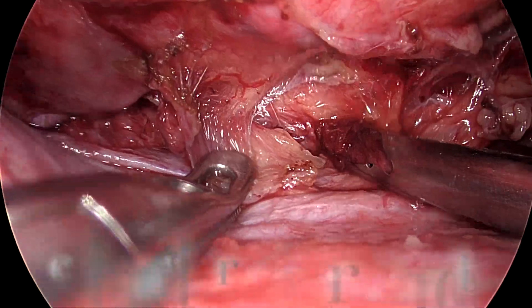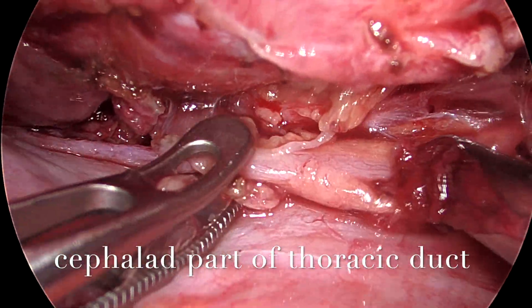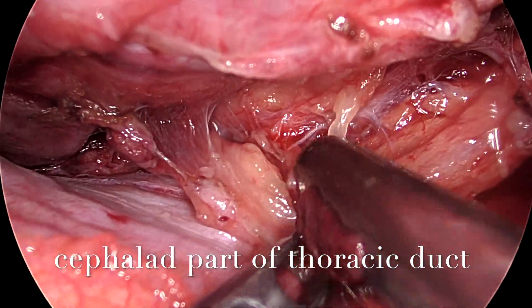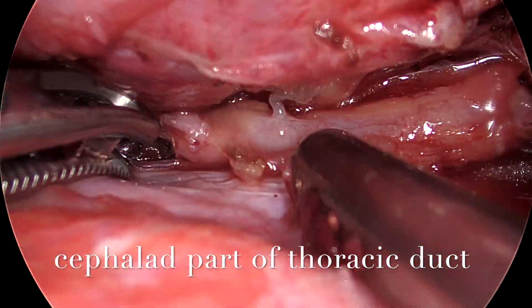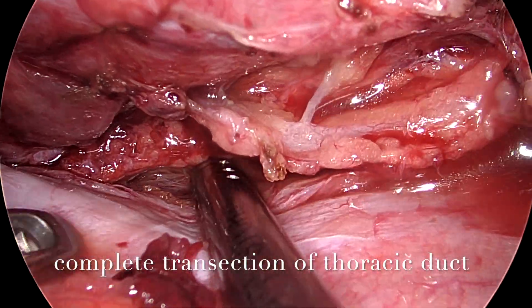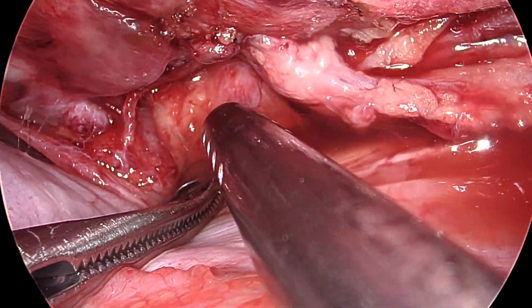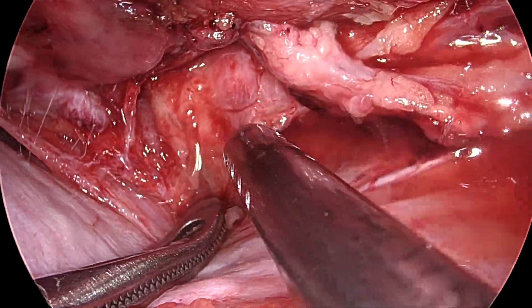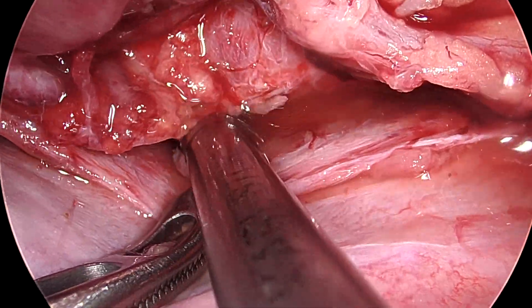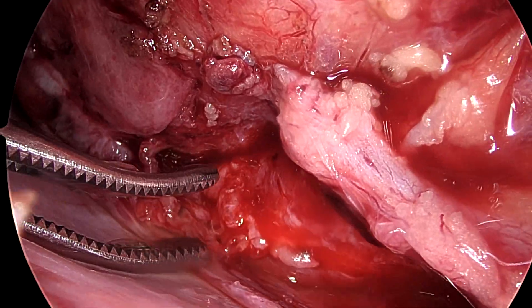At this point we can see the cephalad portion of the thoracic duct with some tributaries draining into it. In this case, both the cephalad and the caudal portions of the thoracic duct need to be clipped. We can see that there is a complete transection of the thoracic duct, with chyle leaking from the caudal end.